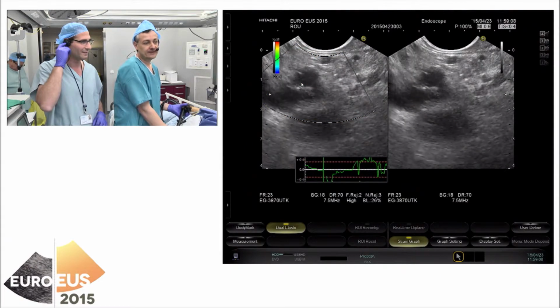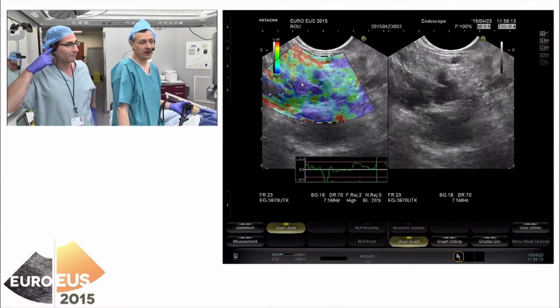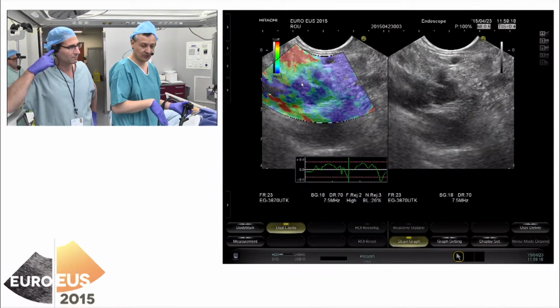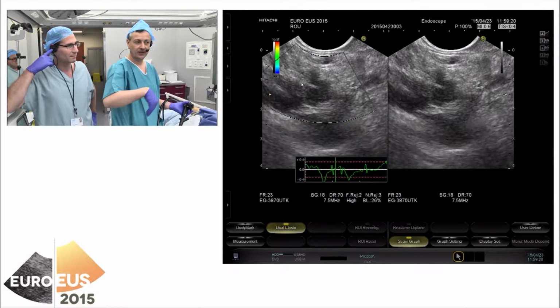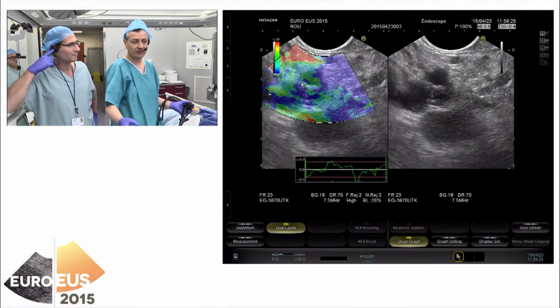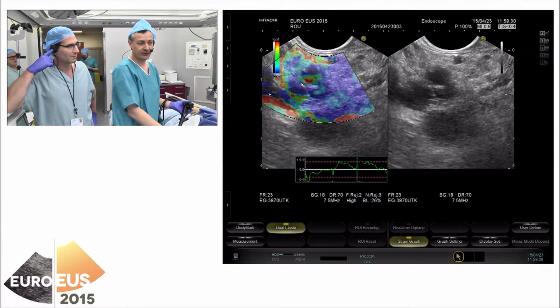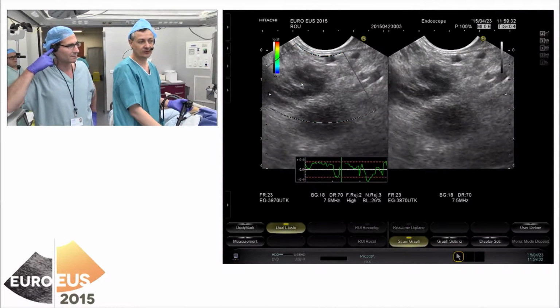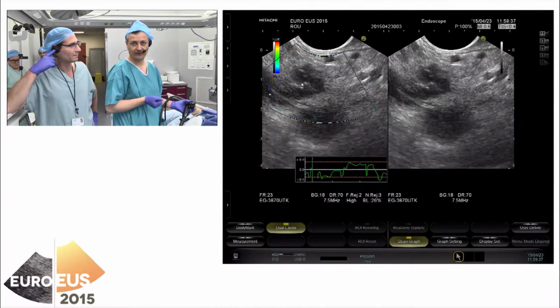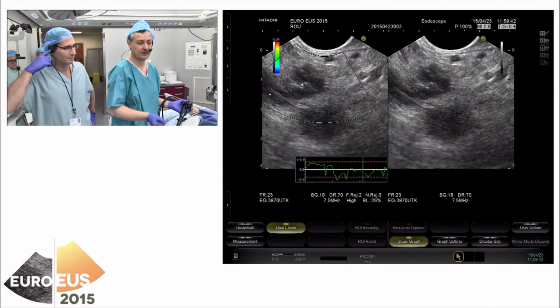So we were discussing a bit about confocal already, and we've discussed it also with Mark, and we decided that confocal would be really difficult in this position because the endoscope is already bent, so we'll have to pass a 19 gauge needle through an endoscope which is already bent, so the puncture would be really difficult. So it's a bit difficult to go towards confocal. That's why the FNA has been done with a 25 gauge needle. It's a bit easier in this position.